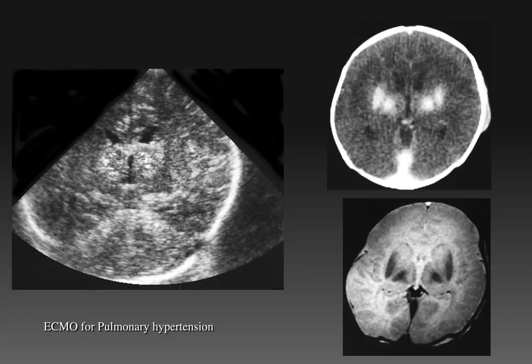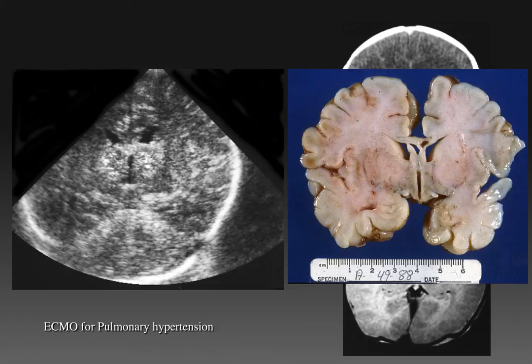This child has very similar echogenic lesions in both the putamina and globus pallidus, as seen on ultrasound and post-mortem CT and MRI. This child was treated with ECMO for pulmonary hypertension. At pathology, we expected to see focal hemorrhages. However, on the gross specimen, there was no abnormality. Only during microscopic analysis did we see that these were related to microcalcifications.